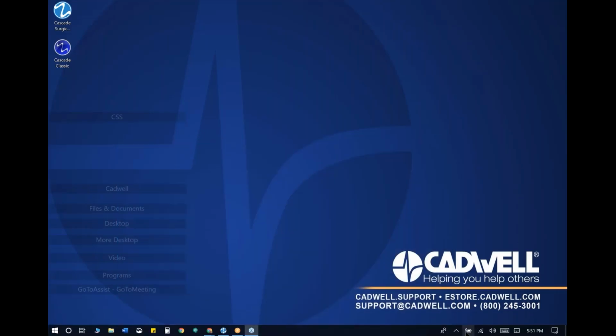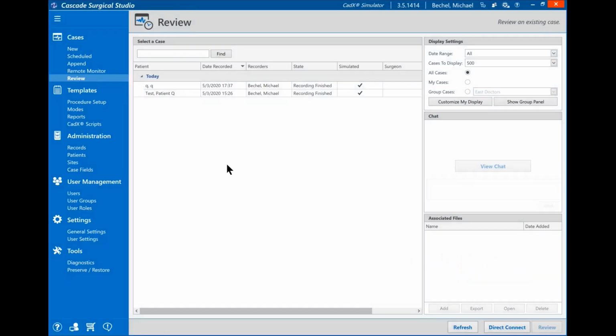We have a little icon, the green check on it. If it's green, it says CADlink client is online and syncing with the server. So as we're recording data, all this data is being synchronized with the server.